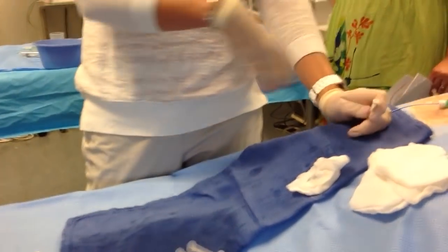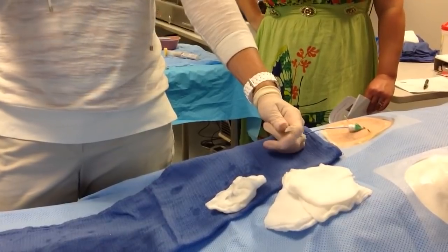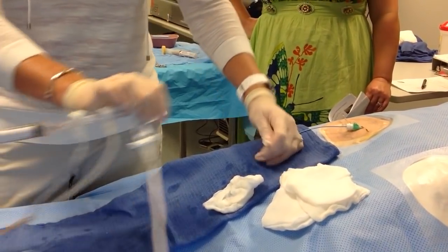And we'll have tubing that goes on. And then the circulator will bring the med rad over. You'll hook up to the med rad, get all the air out. They'll inject the LV. Once you do the LV gram, you disconnect from the med rad. And then you're going to connect back.